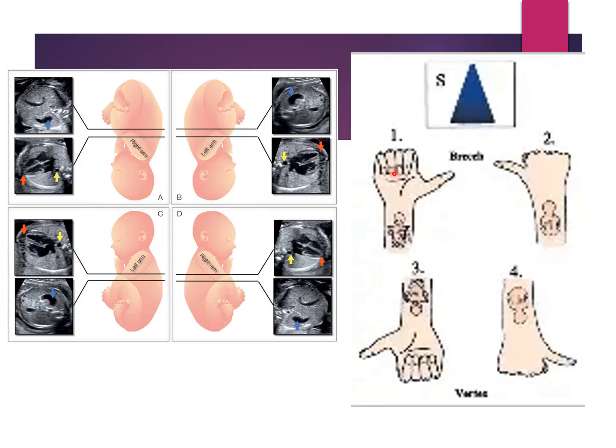So you can pretend that baby is breech. So these top two here, baby is head up. That means butt is near the cervix. So these babies are breech, and these babies are cephalic or vertex. So these babies are head down, head is near the cervix. And you can play with that. And just practice, try and quiz yourself. Come up with something random out of a hat and try and create it.